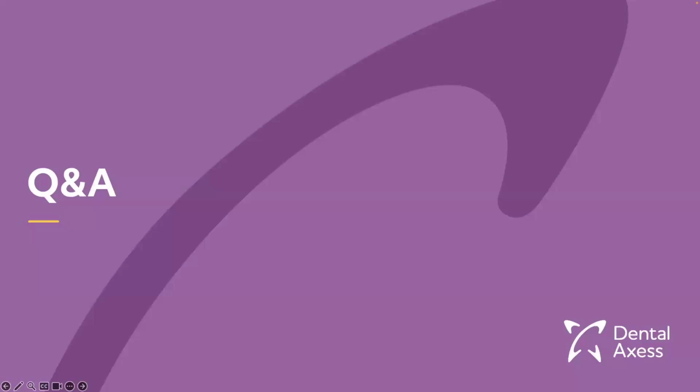Some of the common modifications are like, okay, but I want to improve the midline, not with distalization, with IPR. So I can go there and tell you, okay, IPR was needed on this and that contact, and provide you with information in the same place. So we have a chat channel there with good communication. So that is how we handle the modifications.